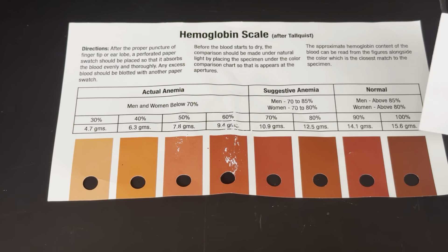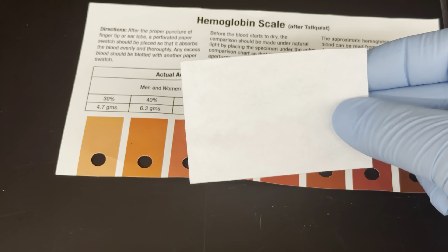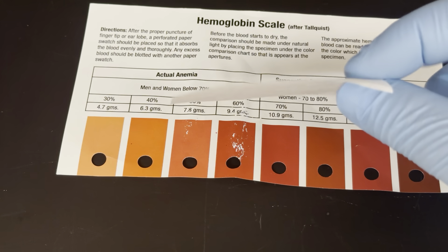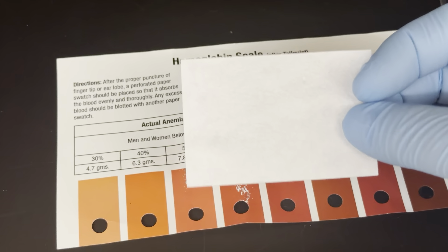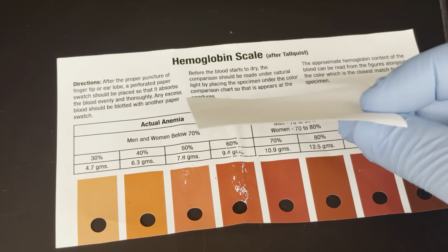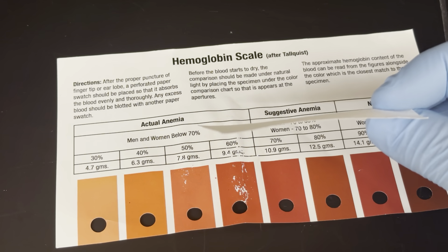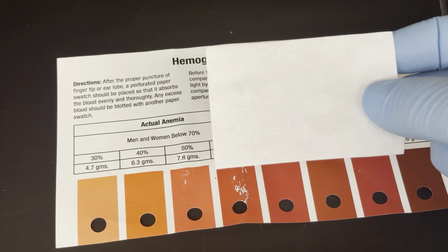Hi, A&P students. This is Mr. Becker here to talk about doing a Talqvist hemoglobin test. This right here is Talqvist paper — a piece of essentially construction paper embedded with a set of chemicals that only react to oxyhemoglobin. For this, we do need real human blood, so your professor will be supplying you with some for this brief test.